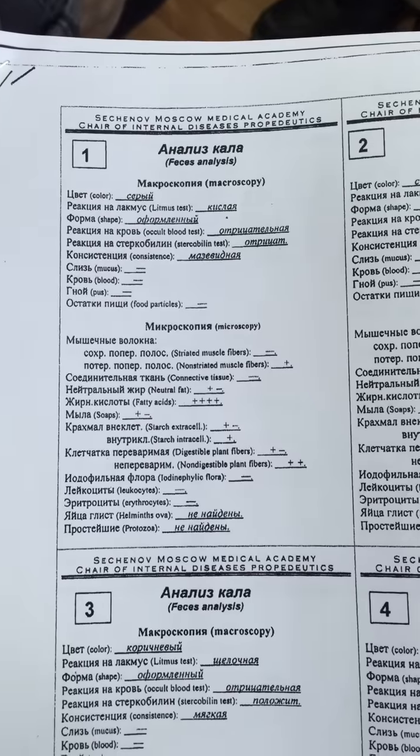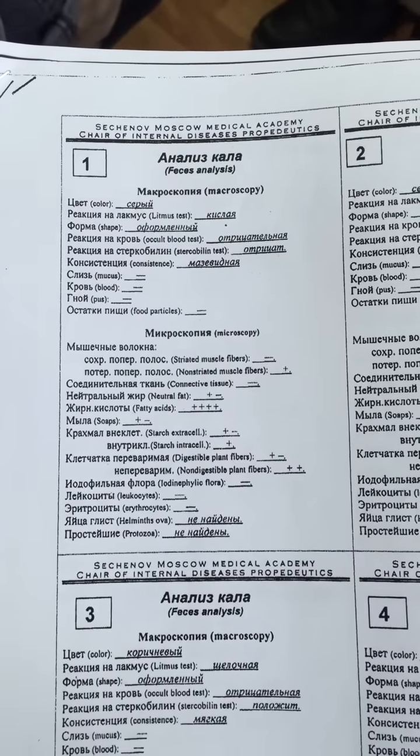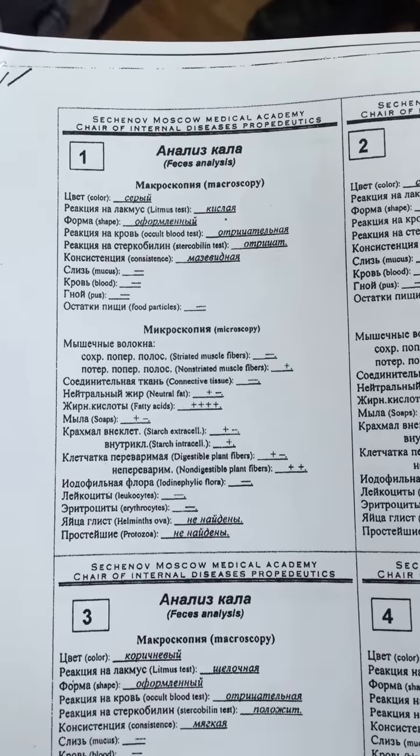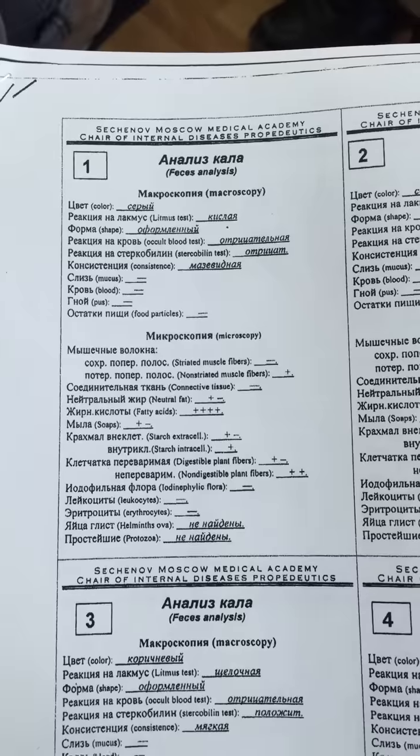Mucus is absent, blood is absent, pus is absent, food particles also absent. So, microscopy.